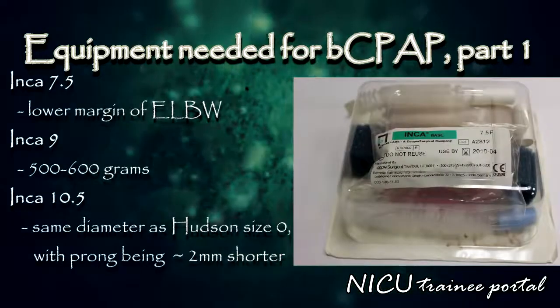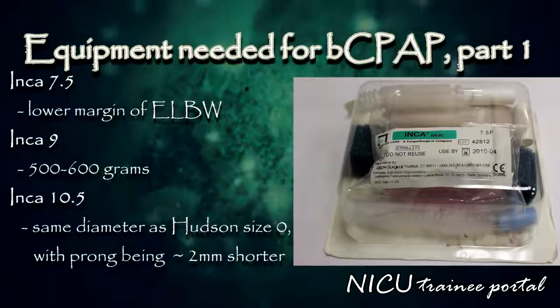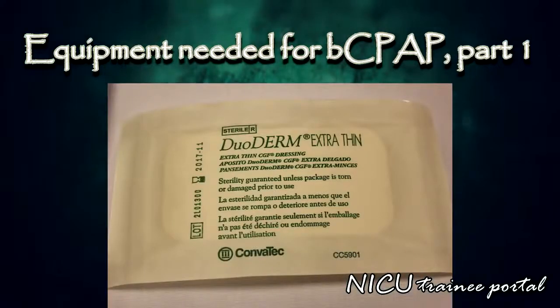In situations where the smallest Hudson prong size is too large for the nares or blanching occurs, we use a smaller sized Inca prong. Extra thin duoderm is cut to the appropriate size. Avoid using bonding agents such as tincture of benzoin, as this can increase epidermal stripping in preterm infants.